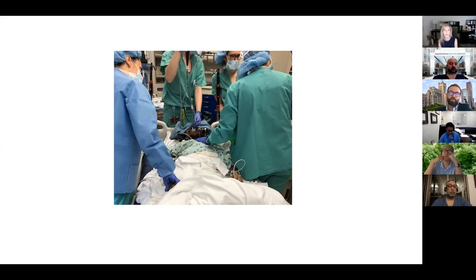We're doing awake here for airway protection because he has a retropharyngeal abscess, prevertebral abscess, a lot of soft tissue swelling. And if you do it asleep, you might lose the airway and you don't have too much leeway into managing it because he's locked in a halo vest. So you do it awake. Team effort. See, everyone's focusing on how to do it. And it was a smooth intubation, luckily. Patient's anatomy was not that bad.